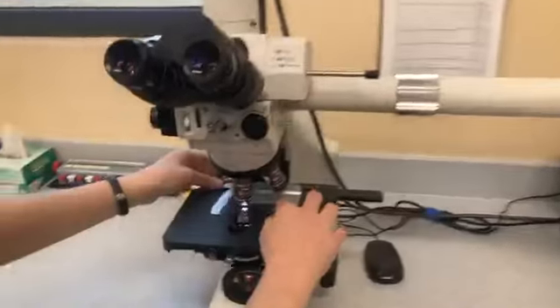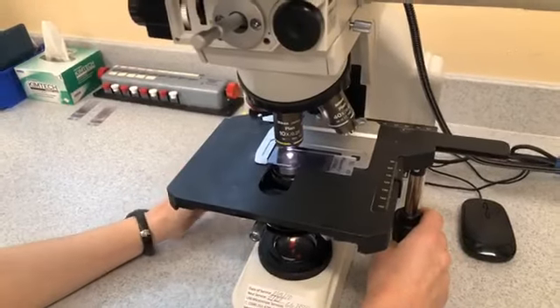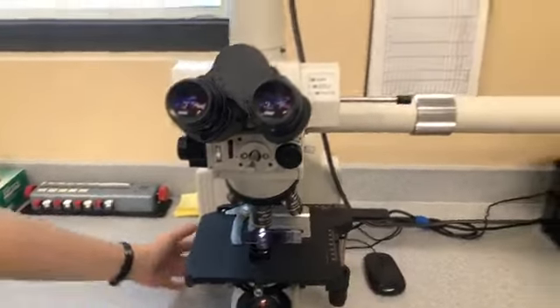And then I can show you the difference between a mammal and a bird, because they're vastly different. Okay, so I have up on the screen, you can see how different it is. So this is a flamingo, and these are the red blood cells. So the big difference is birds and reptiles have nucleated red blood cells. They have a nucleus in each red blood cell. And automated machines can't read these. So that's why we have to do the birds and reptiles manually, and fish and amphibians.